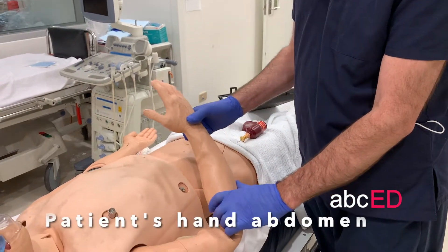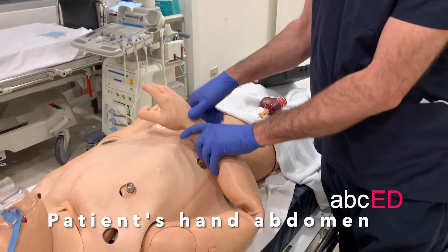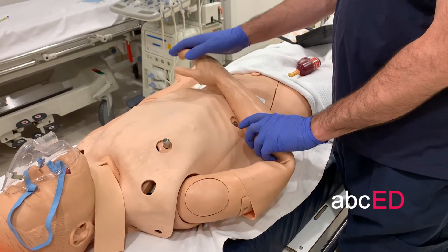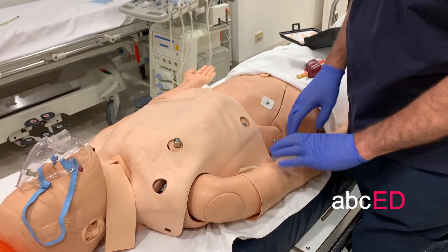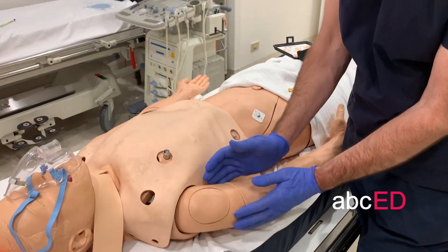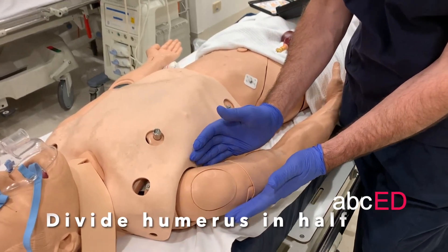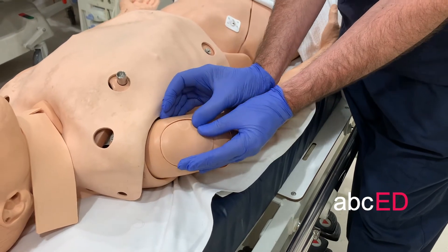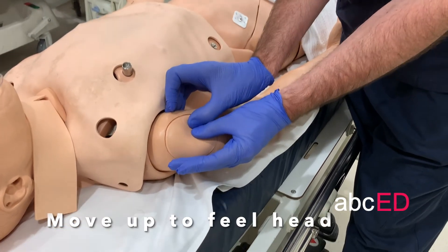The best position is to fold the patient's arm and put their hand on their abdomen. This gives you your target area, which is the humeral head. You can further increase your accuracy by putting a hand here and a hand here, and then dividing that in half and then moving up to about there.